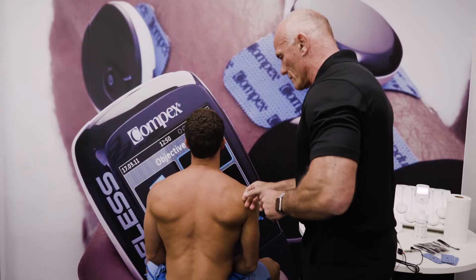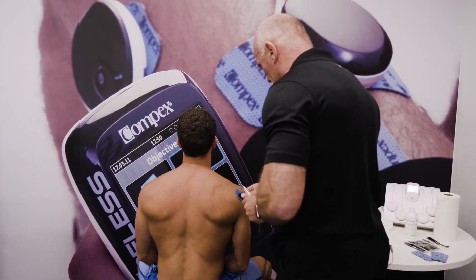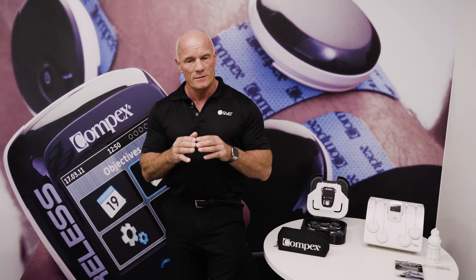In order to do that, we need to pass an impulse through the muscle. The impulse requires placement of electrodes. The most effective place to put your electrodes is over the motor point — the motor point being where the motor nerve pierces the fascia into the muscle. The anatomy books tell us this normally occurs at the junction of the superior two-thirds of a muscle.